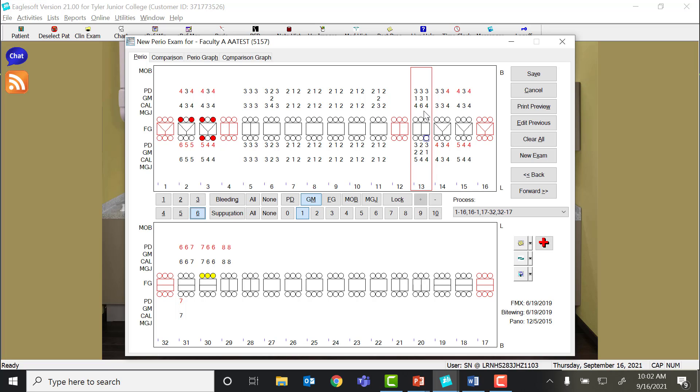So in the case of this number 13, my probe depth is 3. What that means is that the gingival margin down to the epithelial attachment is 3 millimeters. But then on the facial, the patient also has 3 millimeters of recession. So I know by looking at this that the gingival margin is 3 millimeters below the CEJ. And since the attachment level should be CEJ to epithelial attachment, then my attachment loss is actually 6.